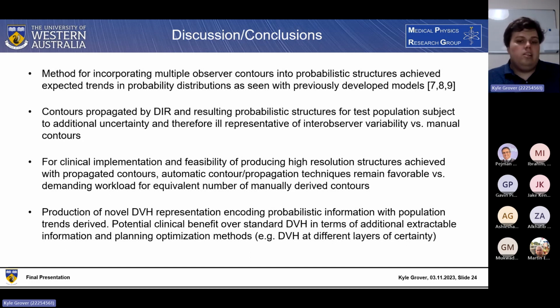However, as you mentioned, for clinical implementation, we might actually want to be leaning more towards the automatic contouring and propagation techniques, mostly due to the demanding workload of getting an equivalent number of contours manually defined to achieve the resolution that we actually managed to achieve in there.